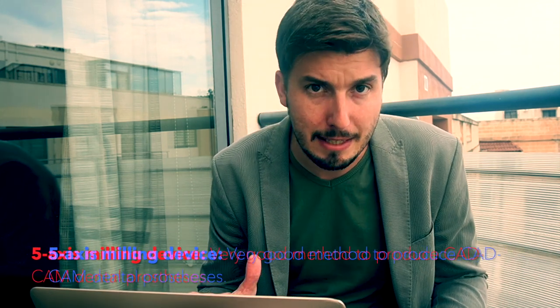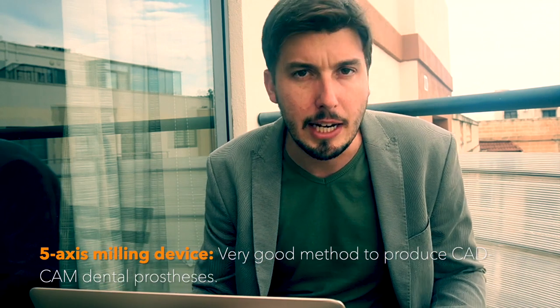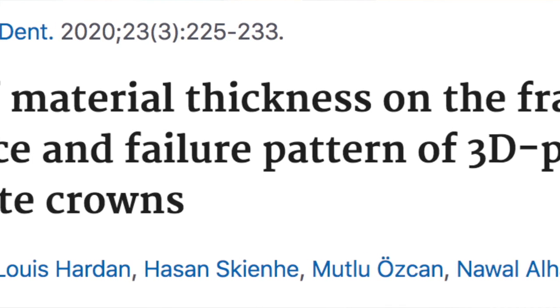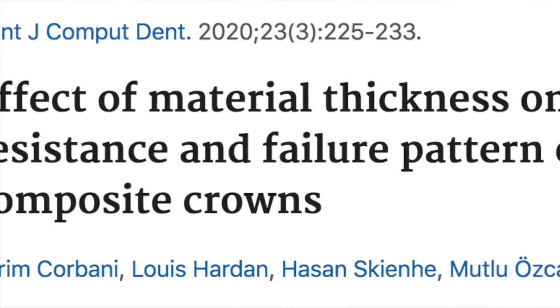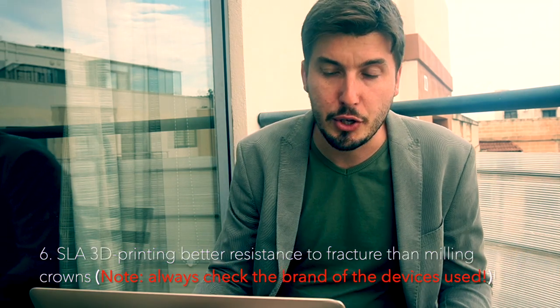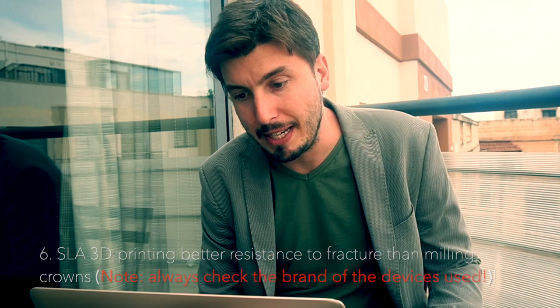Most of these articles used 5-axis milling devices, so those results are clinically relevant. We also have an article from Corbani and Collaborators, published in 2020, again using SLA 3D printed crowns, which showed better resistance to fracture than milled crowns. They also found that the best thickness for 3D printed crowns is 1.5 millimeters.